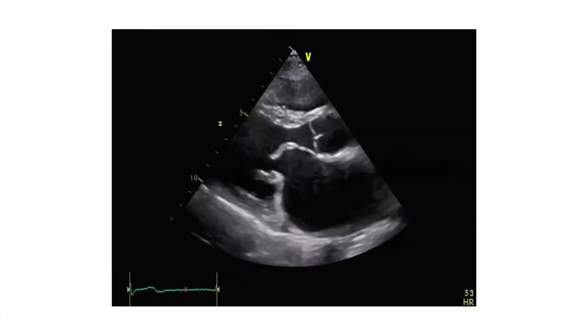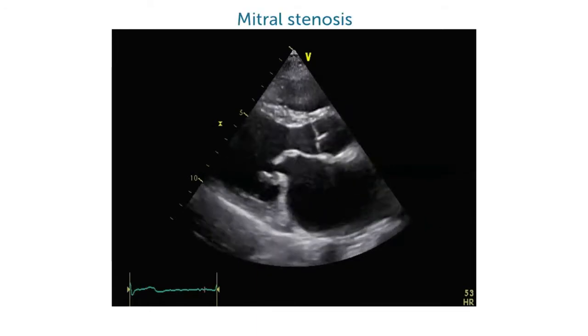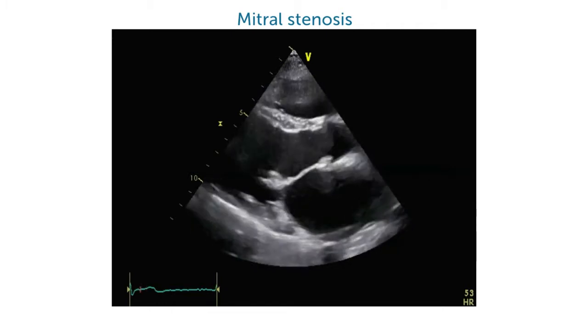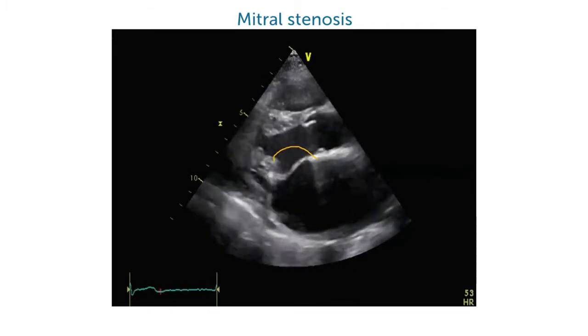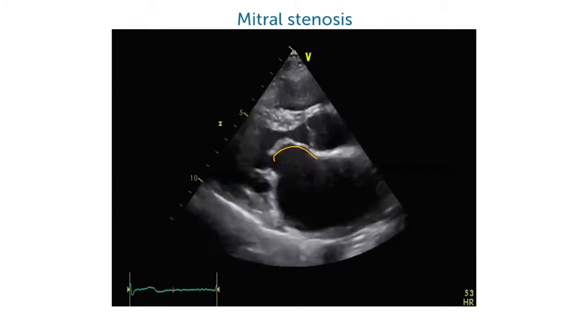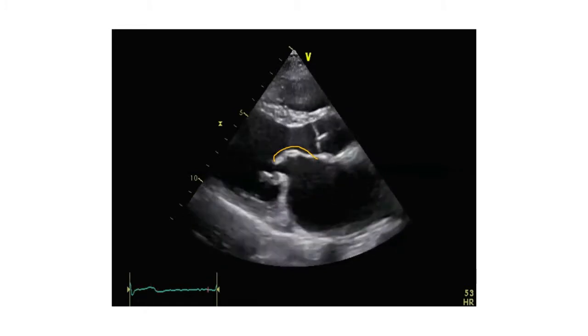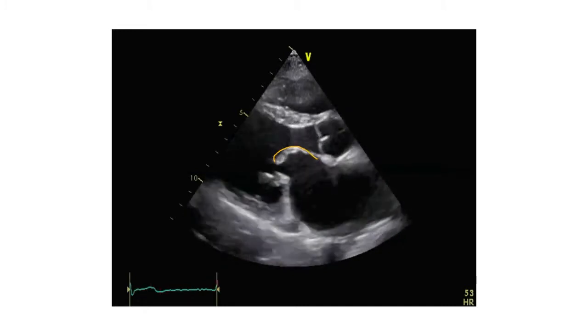Exactly, and here we have a really nice example of mitral stenosis, where with this awkward motion of the anterior leaflet, we will call it later on in the chapter on mitral stenosis, doming of the leaflet, and as soon as we see it, we can really understand mitral stenosis is there. But again, don't worry about that now. Just keep in mind that if you have a valve which has a pathology such as this, it can also be incompetent.